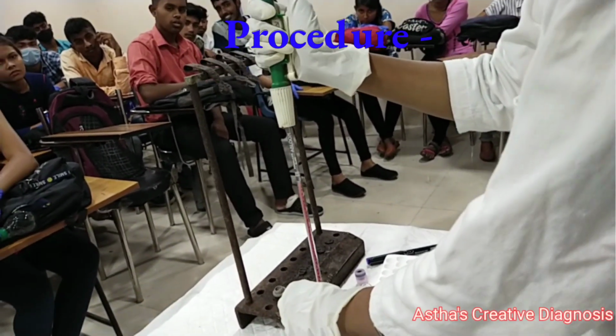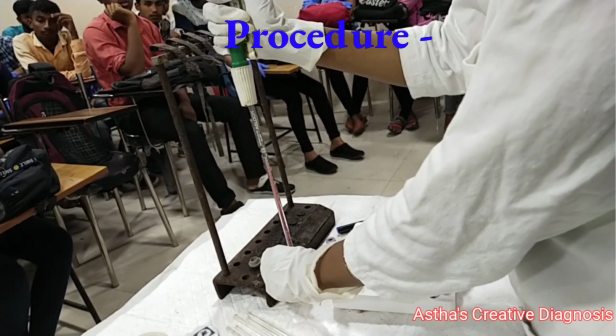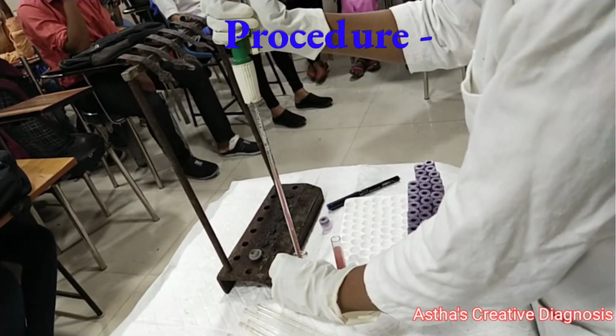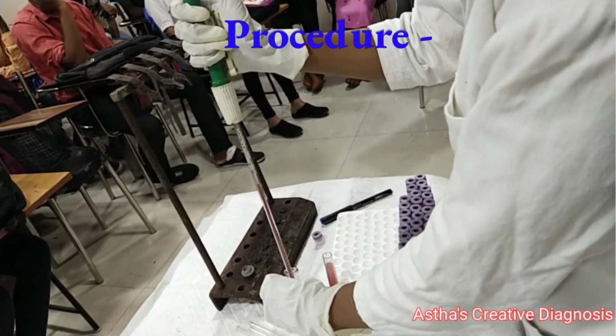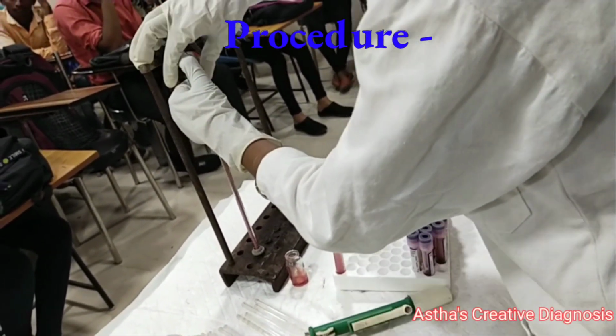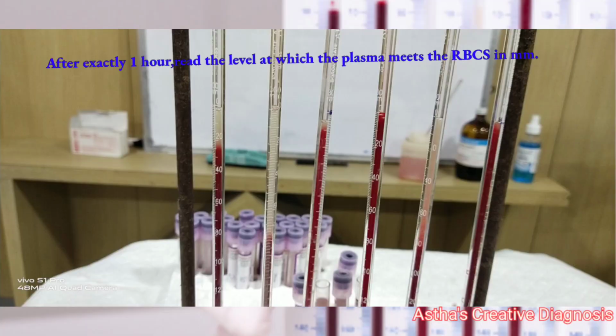After mixing, draw the blood to the 0 mark of the Westergren tube, avoiding air bubbles, and place the Westergren tube in the stand. Check that the ESR stand is level. Set the timer for 1 hour. Exactly at 1 hour, read the level at which the plasma meets the RBCs in millimeters.